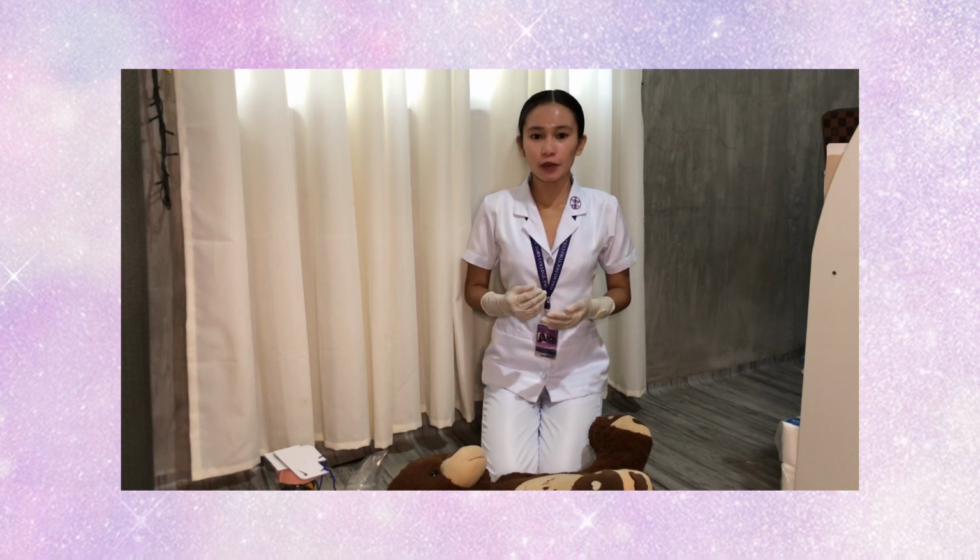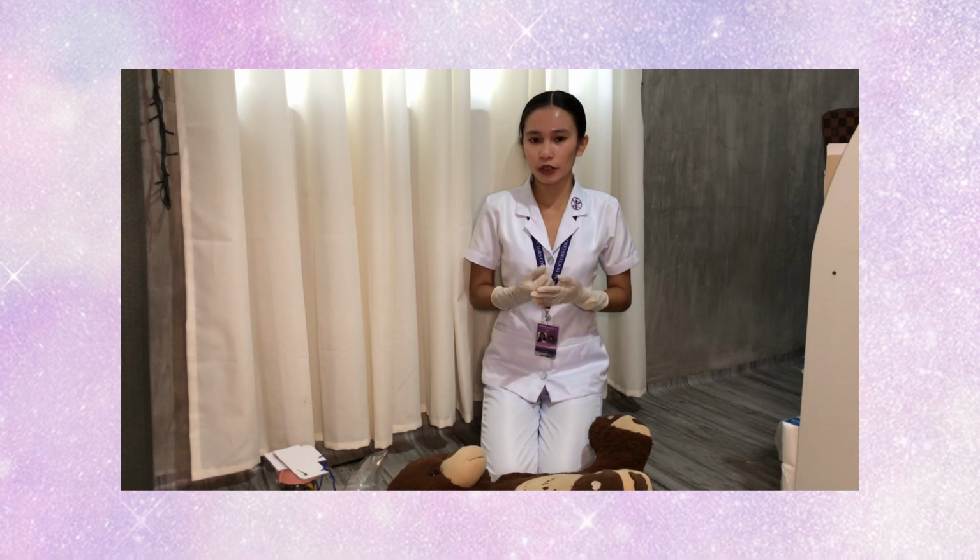And today I am going to perform the basic life support for adult, children, infant, and newborn return demonstration. So basic life support is the emergency management provided by first responders, healthcare providers and safety personnel to people who are experiencing cardiac arrest or respiratory distress. So now I am going to perform the adult cardiopulmonary resuscitation and AED skills.